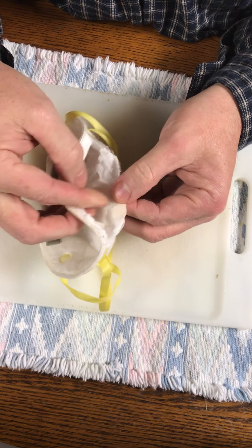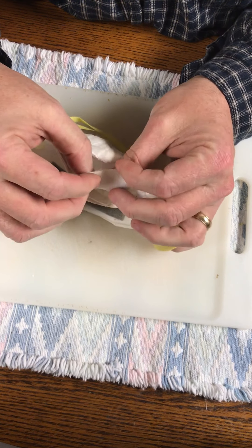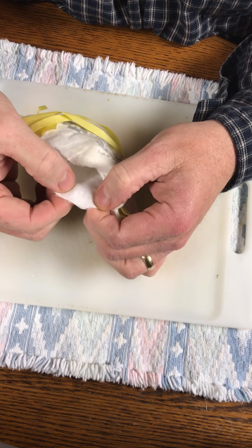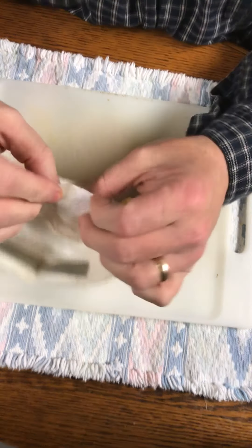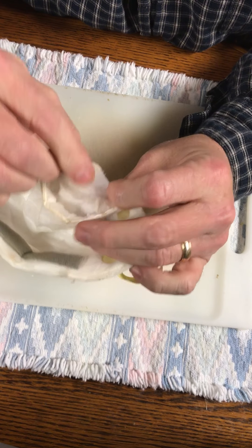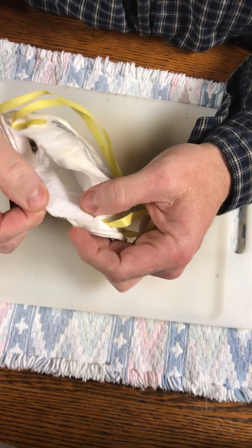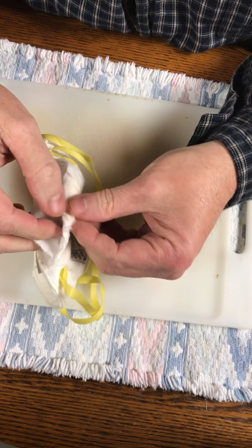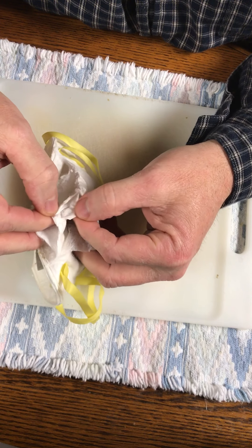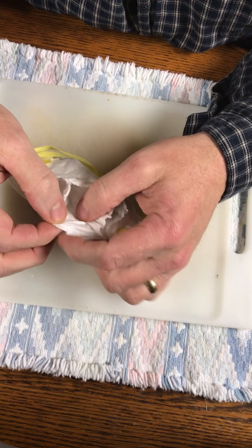Let's just peel this back. The inside layer is a really tight woven material - it's sort of like Tyvek, kind of what it feels like.